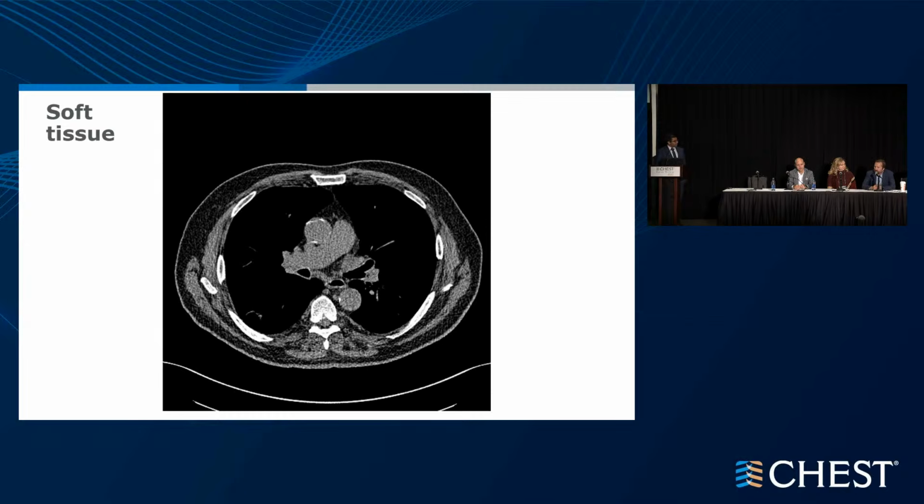The left-sided lesion is still 1A. It's under 3 centimeters, but it's central. And so that also, at least per NCCN and even the ACCP, the older guidelines, should be staged because central lesions have a higher rate of mediastinal disease. So this patient deserves an EBUS, and therefore I think you should do the EBUS. And then there's some abnormal mediastinal findings here as well, which I'll talk about a little bit more in a minute. But so I would target all of these things.